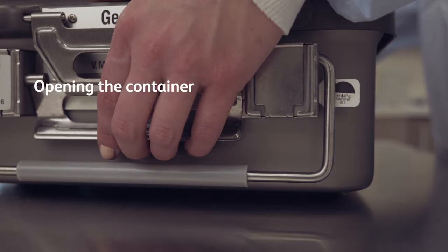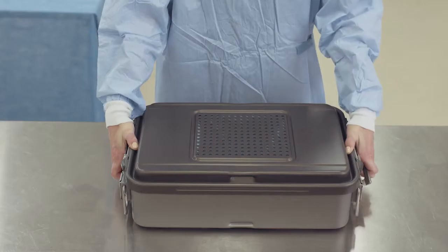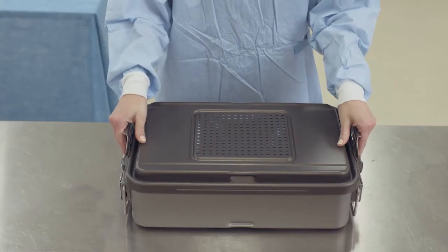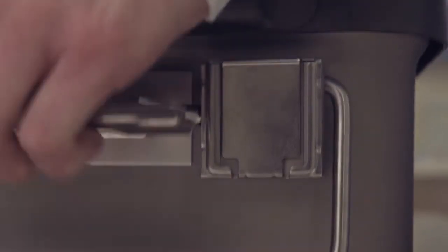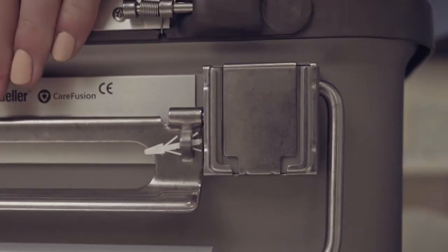To open the container, place your fingers under the bottom latch on both sides of the container. Gently pull upward and outward on the bottom latches. This motion disengages the lid from the bottom and breaks the tamper-evident arrows.